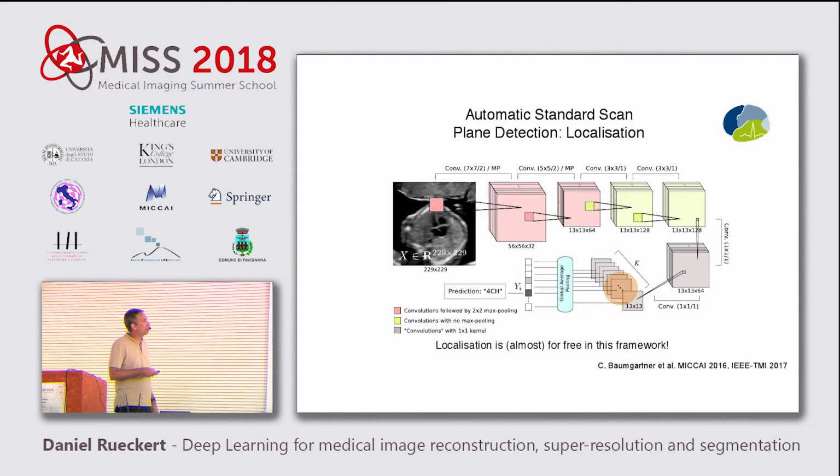So we can basically now backpropagate the activations and create a sort of saliency map in the original video. And using the saliency map, which is a very simple form of a saliency map, we can effectively threshold that and detect where the object is. And the nice thing is you can do this without having trained the system by telling it where the object is. We only tell the system what the object is in the image, but not where it is. So what you see here is some of these saliency maps and how you can use them for object detection.